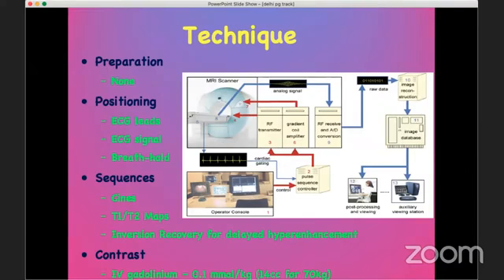The positioning is important. We use special non-ferrous ECG leads. That's very specific to the MR. The ECG signal is very important because the whole basis of getting good pictures is from the systolic and diastolic components. Breath hold again is essential, but with the newer MR sequences, we can do without it by doing what is called the diaphragmatic navigator sequences, which use the diaphragmatic movement to time it. However, good breath hold helps in getting those pictures better and also faster.